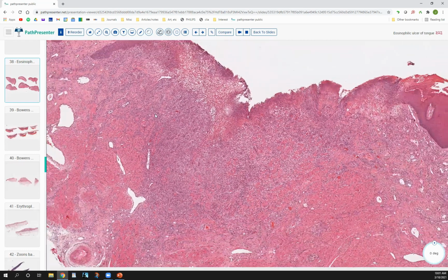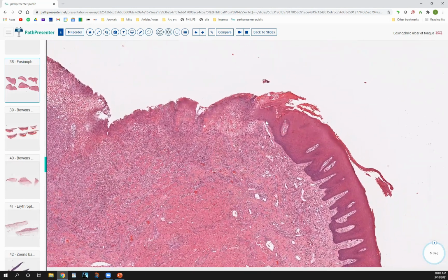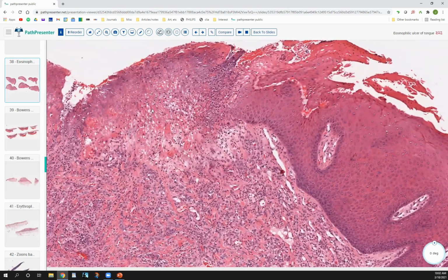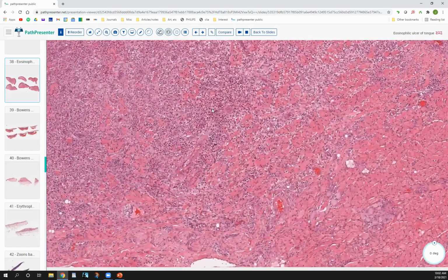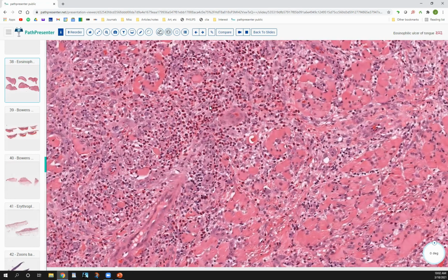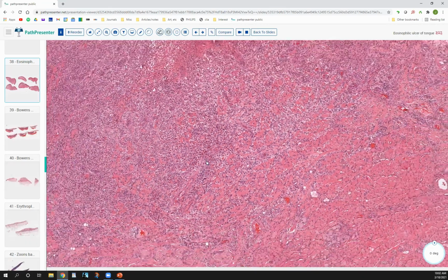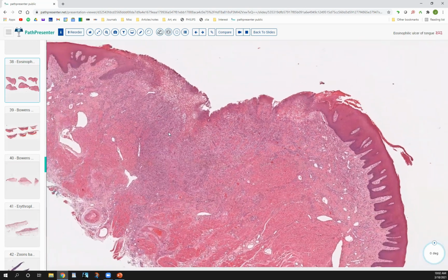Now, what I usually like to do is make sure you're not dealing with a couple of things, infectious, in particular herpes, or tumors. And often at the edge, you look for inclusions, which are absent here. So I don't think that's what's going on. But then I like to go to the composition of the cells. And what's unusual about this is that there's quite a few eosinophils. Eosinophils are typically not something that you would associate with ulceration, not in great number like this. So this is actually the tongue, and this is actually eosinophilic ulcer of the tongue, which is an unusual condition.